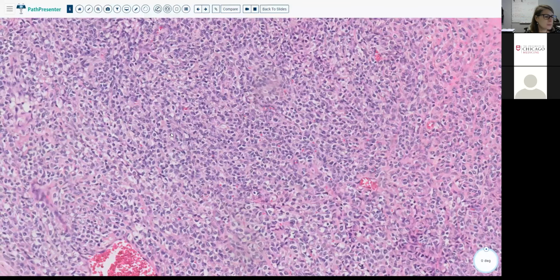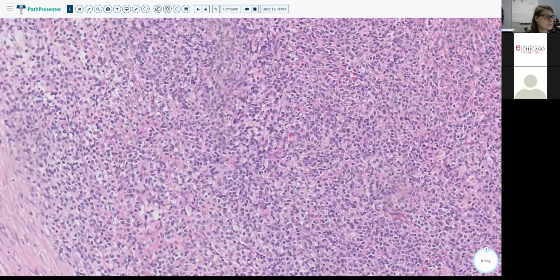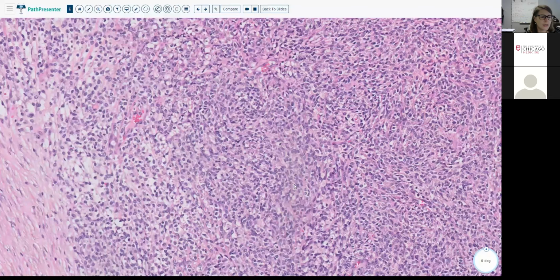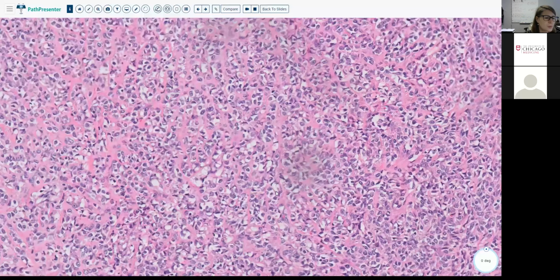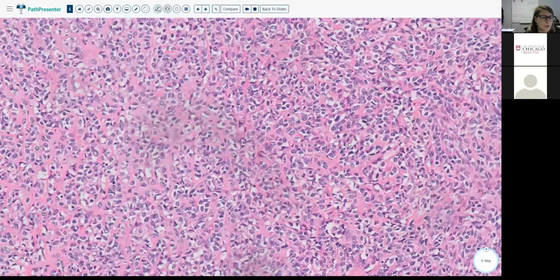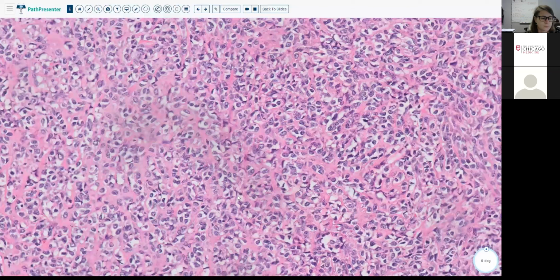This is one of these tumors that could also occur in bone. And so if you were to have placed this thing in bone, what's one pitfall in interpretation of this material? Trying to call this osteoid? Trying to call this osteoid, exactly.